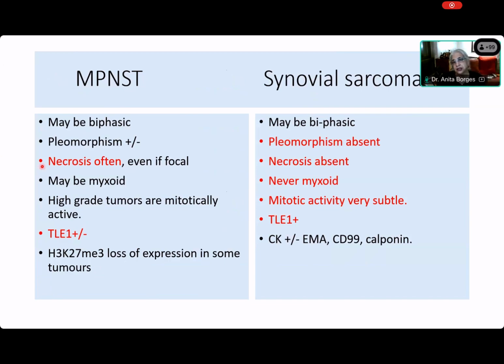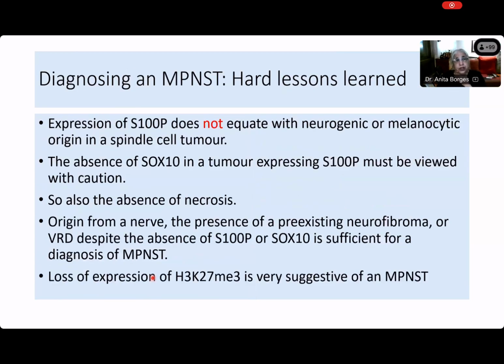high mitotic rate. You do get TLE1, but you can't rely on that, as I told you, because TLE1 is regularly expressed in MPNSTs, and I would not make a diagnosis of an MPNST without necrosis. Of course, MPNST can be pleomorphic and lots of other things. Okay, so there are some lessons that we learned.